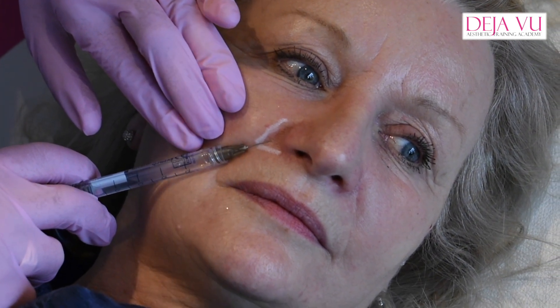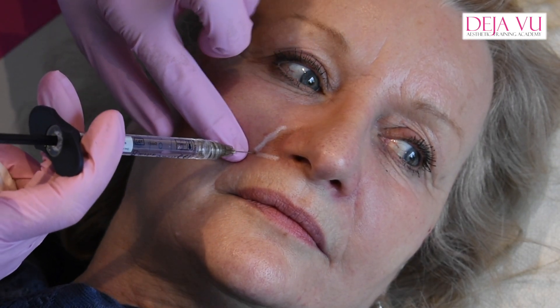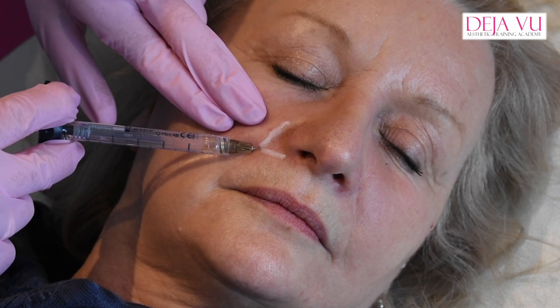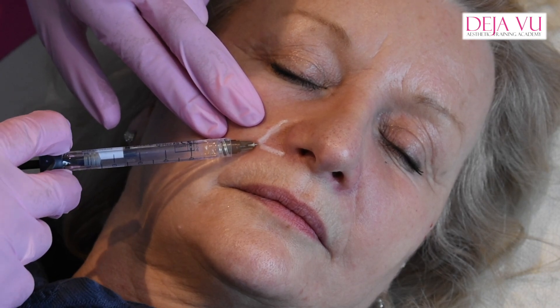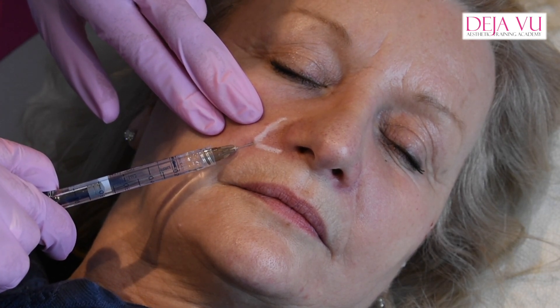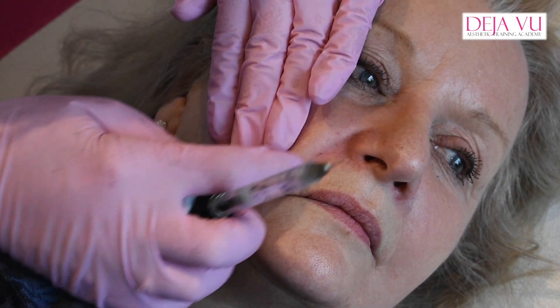I measure from the corner of the nose where I want for the needle. I go in at 90 degrees, put a third of the needle in, then angle it back, and you should be pretty safe then. So I'm going to fan it, injecting very slowly on the way out. I'm going to do three fans here. Stop injecting before you come out. And then by pushing that, you can actually see where I need to go — you can see the line come in, so I'm just going to overlap it slightly.